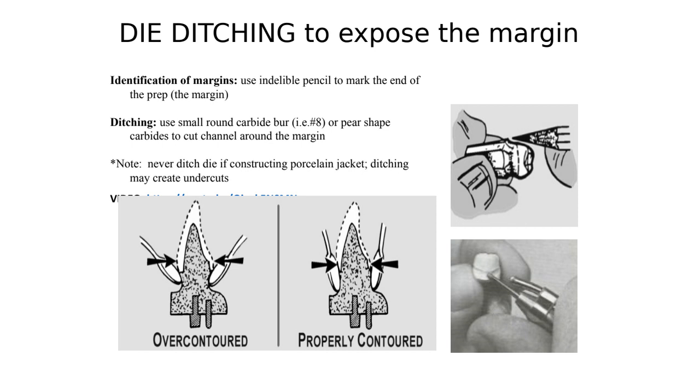Okay, so don't use the lead pencil. Use the ones that you have in school, the blue and red. You can use either the blue side or the red side to mark your margins so you can identify the margin and see it when you start working and do your wax up.